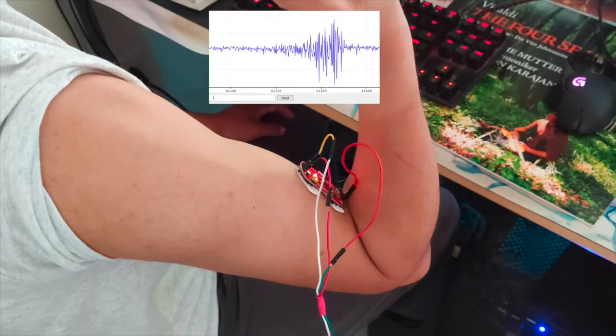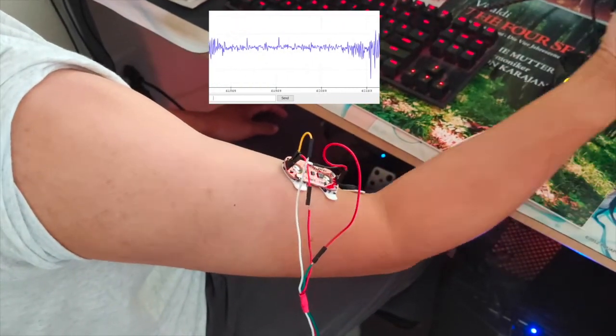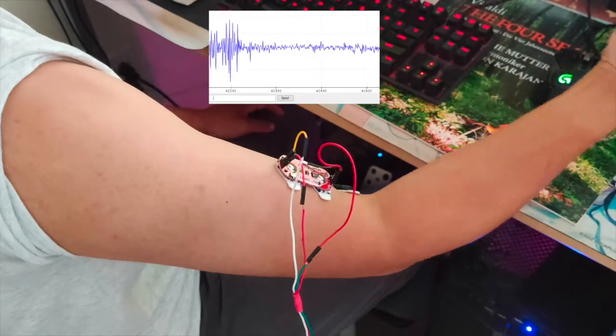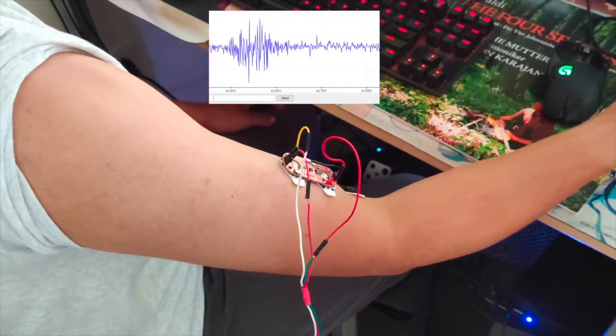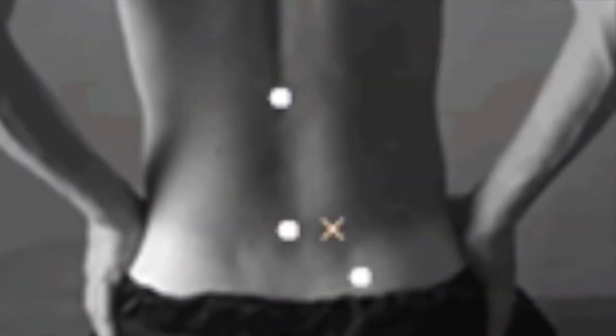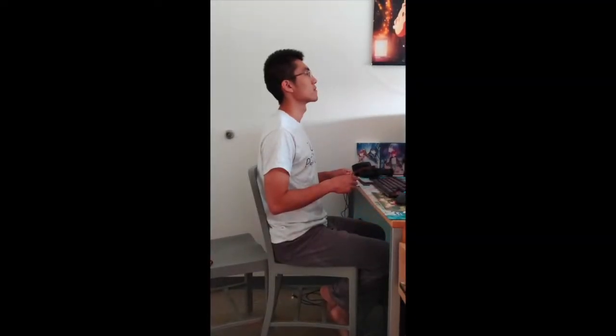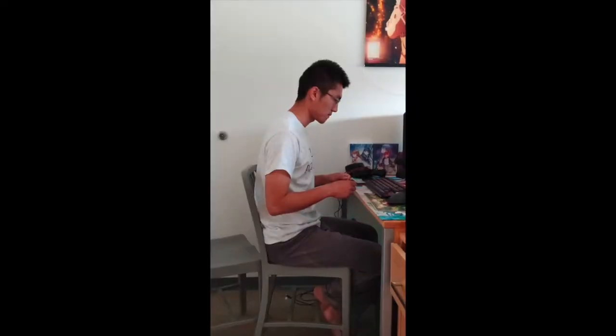First, we want to show you how EMG signal responds to intense muscle movements. For example, now we are exercising bicep, and you can see the EMG signal. In this project, we focus on the lower back muscles. And right now we are seeing the sitting straight posture. This is the hunched posture.